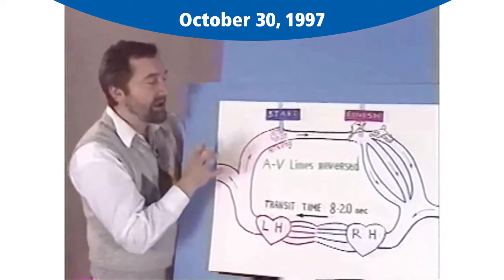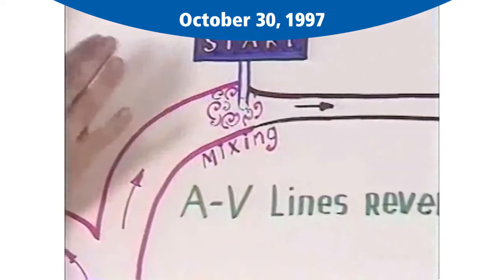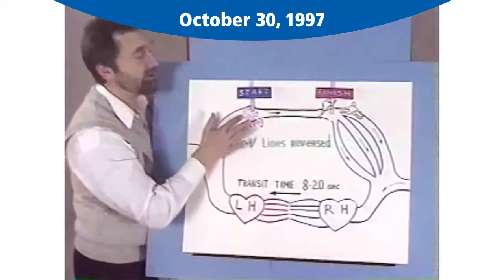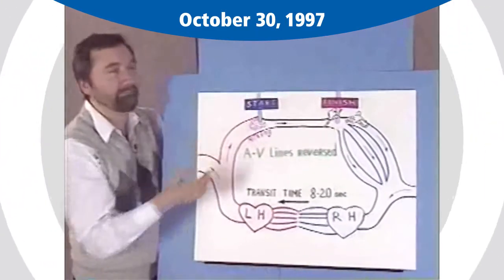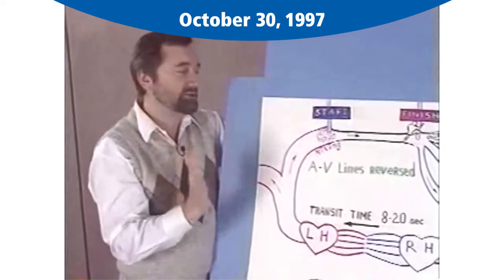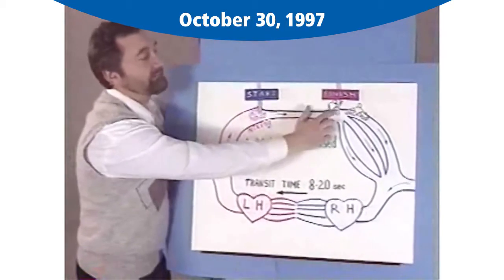Why do we do this? We create an artificial circulation loop. Now the outflow of the venous line is mixed with the inflow of the vascular access, creating mixing conditions. It's a fundamental requirement of all the dilution technologies. As soon as we meet this requirement, we can measure shunt flow here, right?